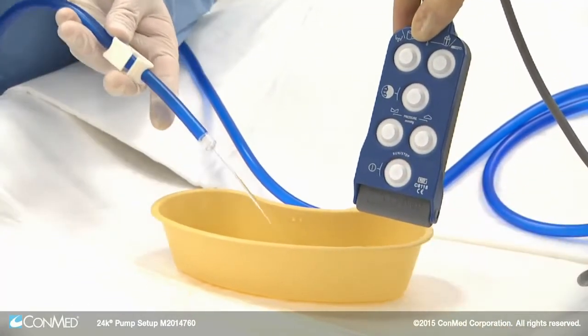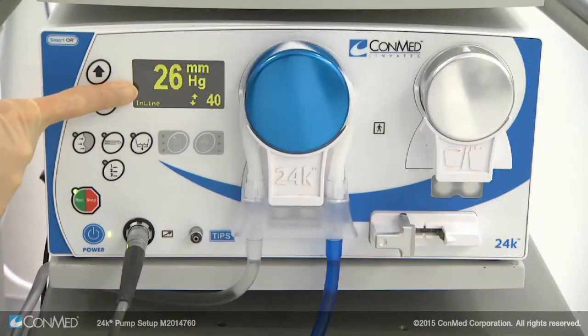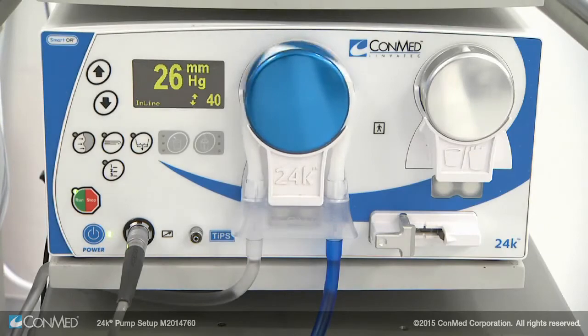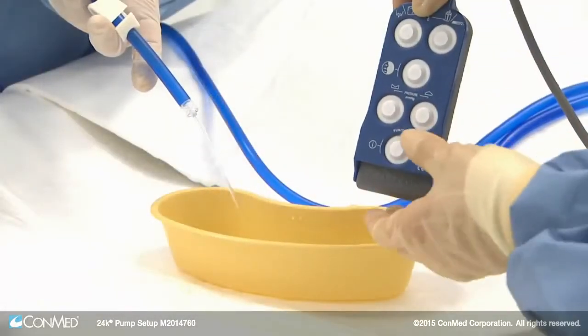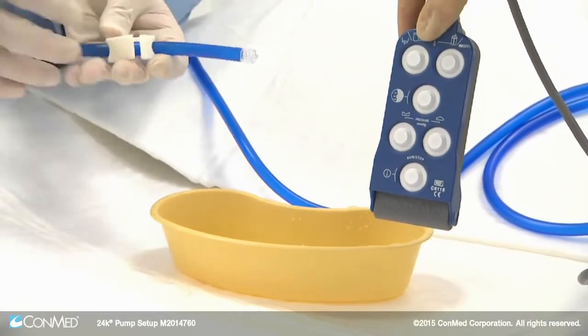Press the run/stop button to run fluid through the line. The blue inflow rotor will spin and the display will show the pressure reading. Press the run/stop button again to stop the pump. The 10K 100 inflow line is now primed and ready.